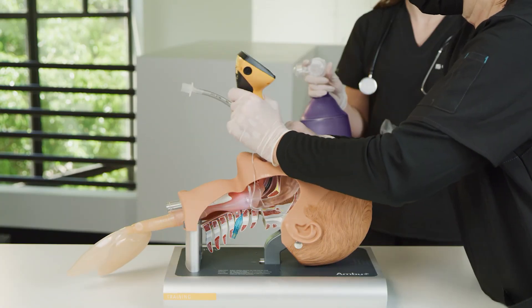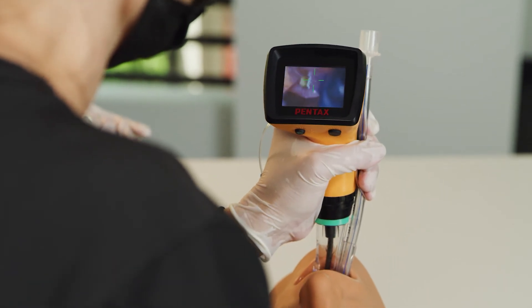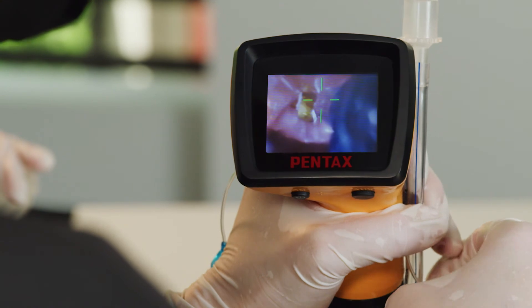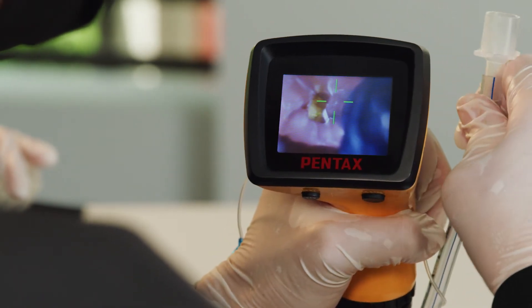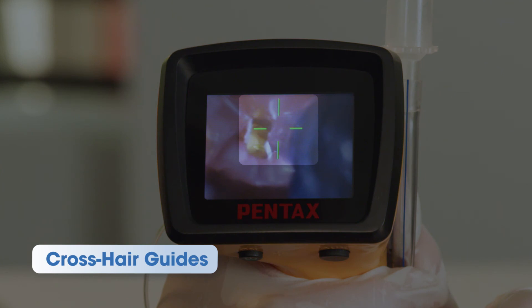The NK-AWS S200 can perform tracheal intubation safely and securely without requiring high skill, because the intubation is performed with a glottis-aligned target mark. These crosshair guides improve success and offer faster intubation rates for less-practiced clinicians for accurate endotracheal tube placement.